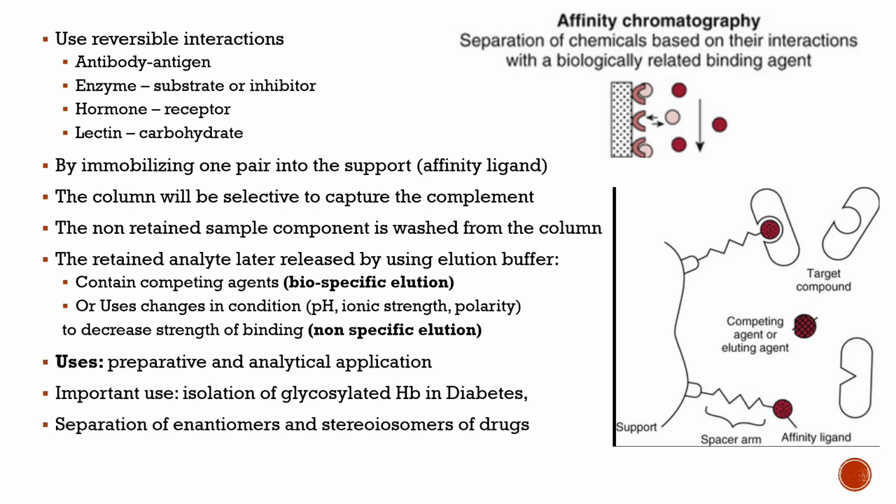It is used for preparation and analytical application, and an important use is for isolation of glycosylated hemoglobin in diabetes. You will see this in hemoglobin HbA1c methods by HPLC.